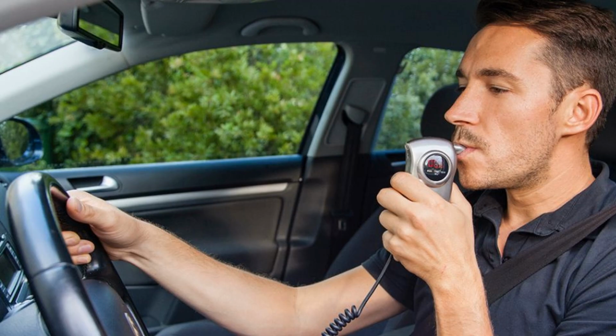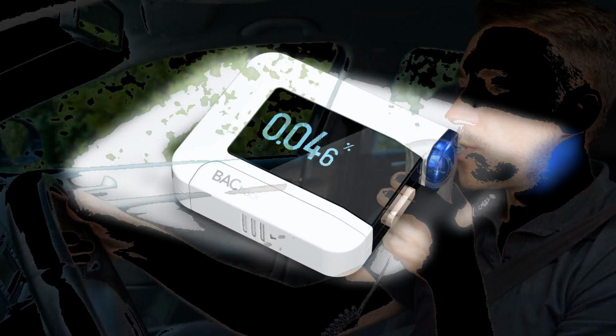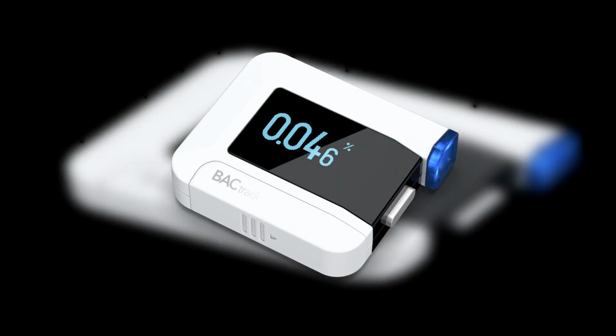For this purpose, the device has a special sensor, the electrical resistance of which changes under the influence of ethanol vapor and acetic aldehyde. Each model of breathalyzer has a detailed instruction manual, but there are such general requirements. The test should be performed at least 20 minutes after drinking alcohol. A repeat test is carried out after 10 minutes.